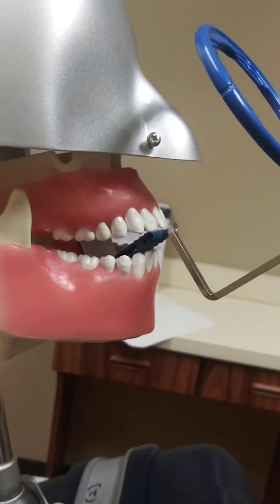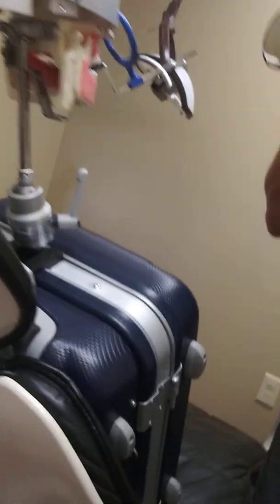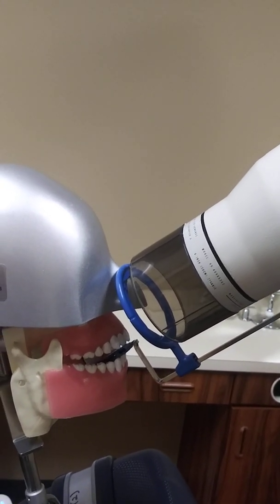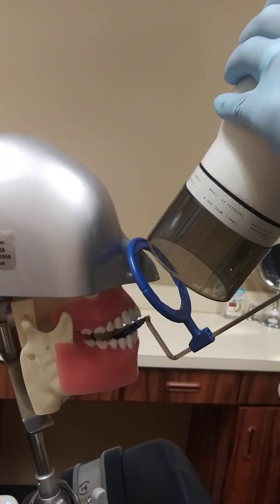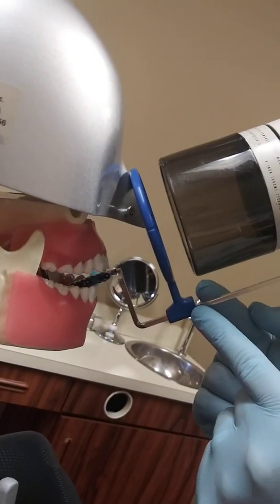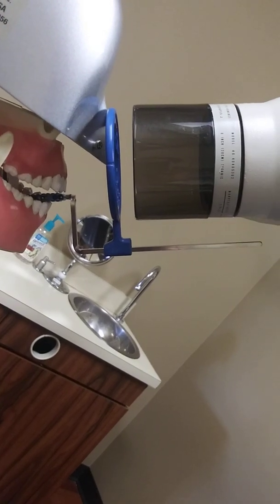It's not going anywhere. The next step is we would move this circle as close to the patient's face as possible. Then we'd reach over for our equipment — here's our tube head. We would position this and line it up directly with our circle. It's pretty simple — it's point and click. It is directly lined up on the circle. What is not correct is if you position it at an angle — you'll notice that is not directly straight on, and you're going to get an angulation error. Same thing for turning it like this — another angulation error. It needs to be directly on point and centered with that XCP. You'll notice this arm bar is directly in a parallel position; from a numerical standpoint, this would look like an equal sign. The circle lines up directly with the circle, which allows us to take an image and hopefully get a good one.